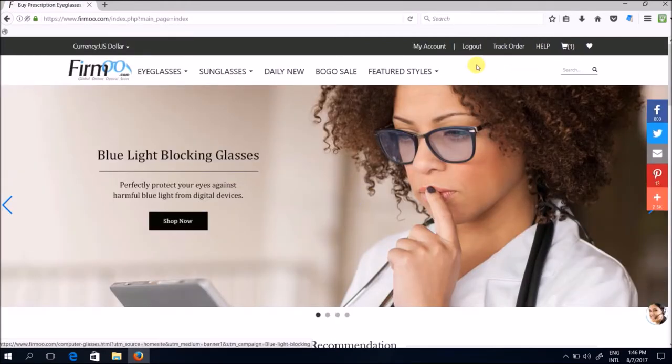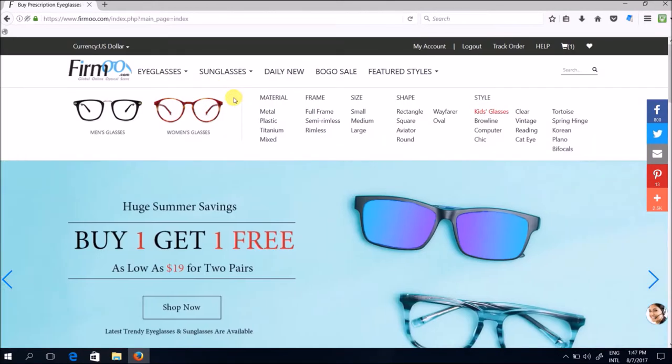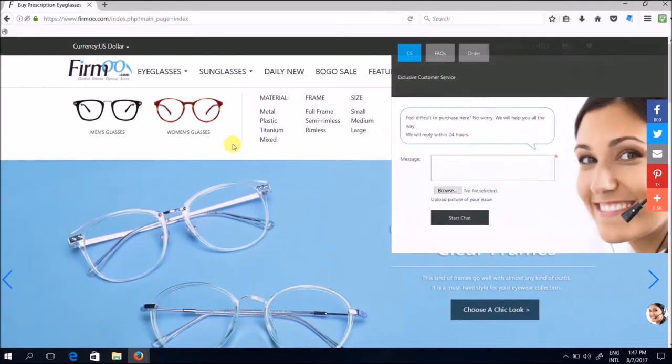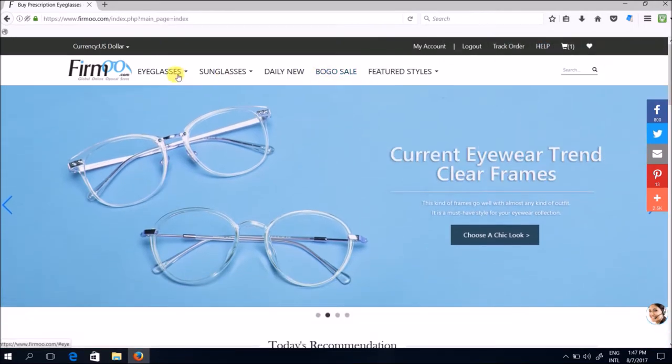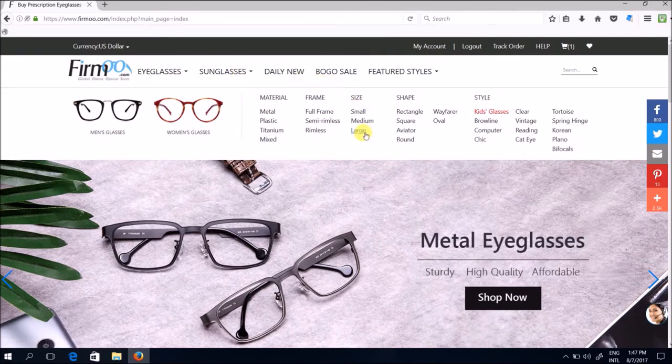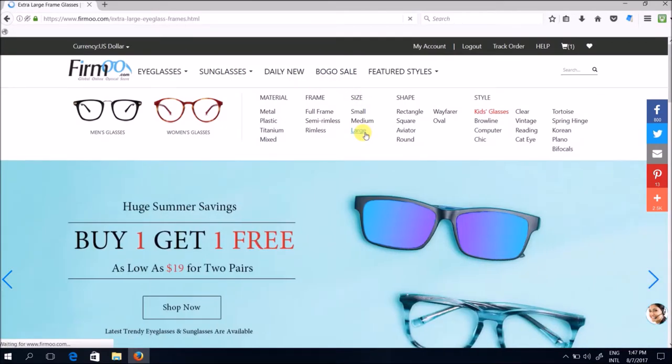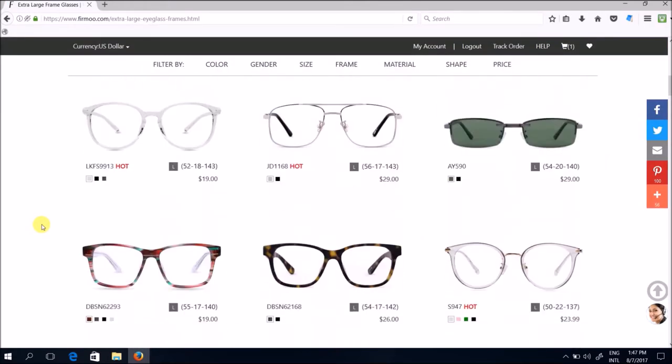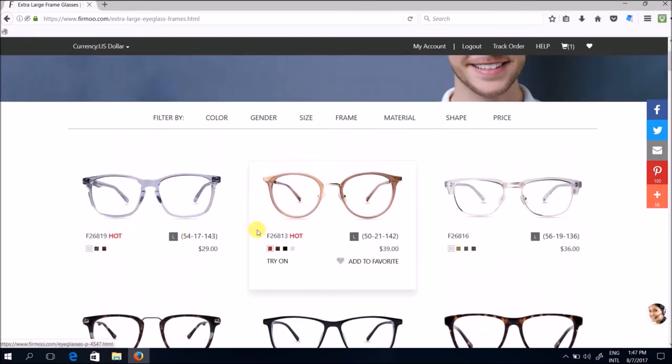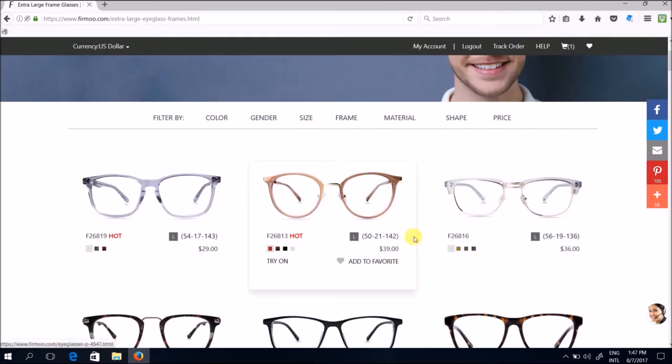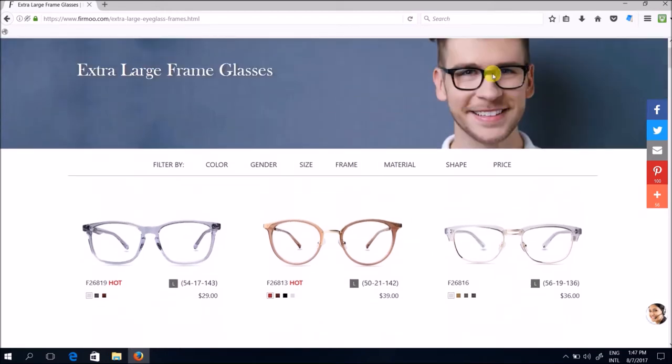Okay so now I'm logged in. If you click on eyeglasses, the designs are already filtered according to subcategories according to material, frame size, shape and style. So for instance, like for myself I prefer large frames so I'm just going to go ahead to shop according to size and click on large so the results will all be filtered according to larger frames. Now the numbers that you see here, the measurements that you see here, for instance 50-21-142, indicate the various dimensions of the design. I will show you what these figures mean in a while.